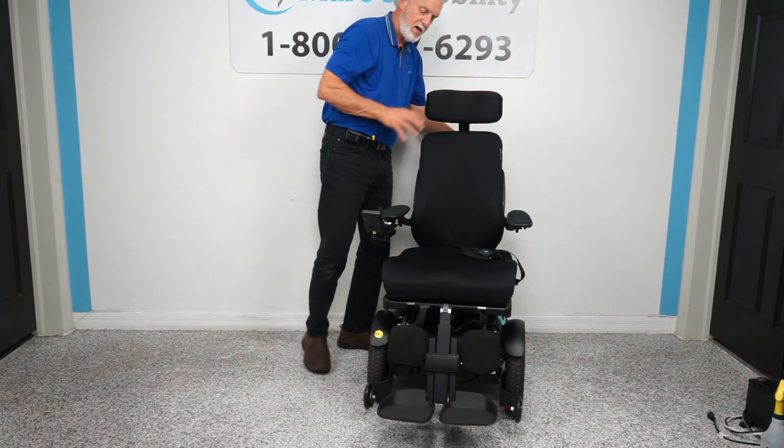It's very quiet — you can barely hear the chair. When you charge the batteries, you take your Permobil charger, plug it in here, and as soon as the light goes to full, the charger will stop charging automatically. These are smart chargers — you don't have to babysit them. Plug them in and walk away; when the batteries are full, the charger stops.